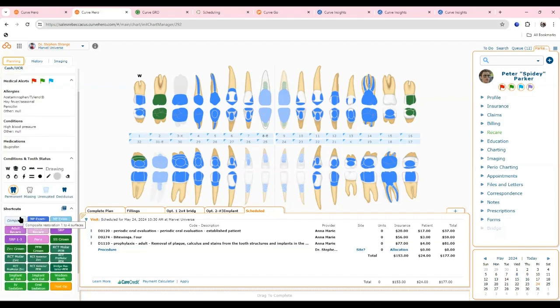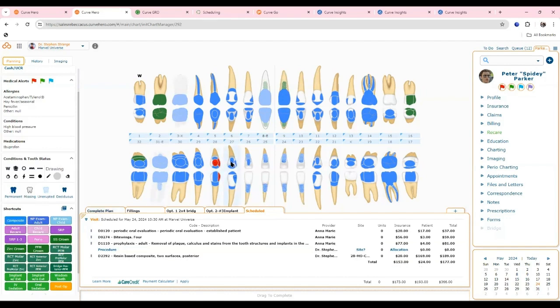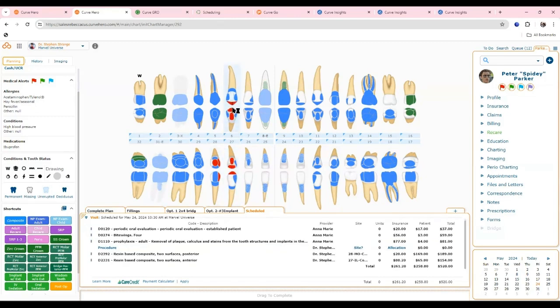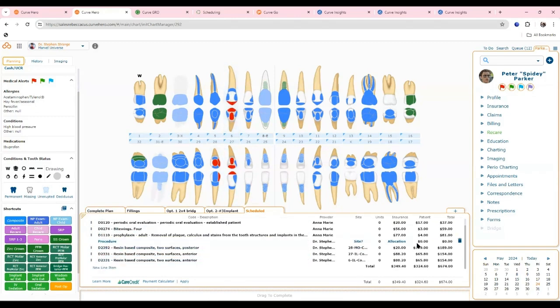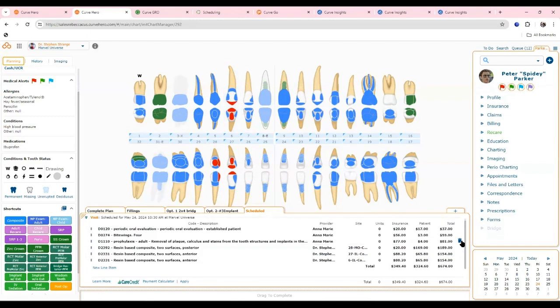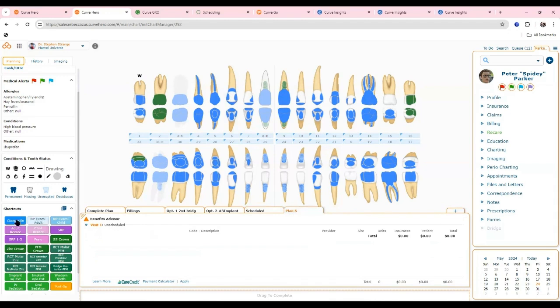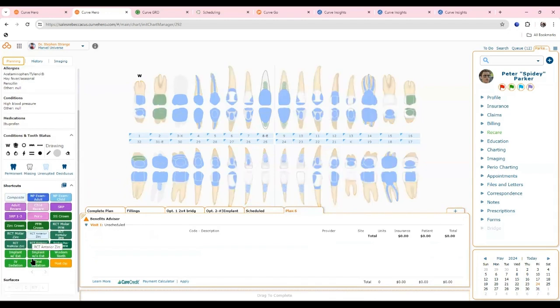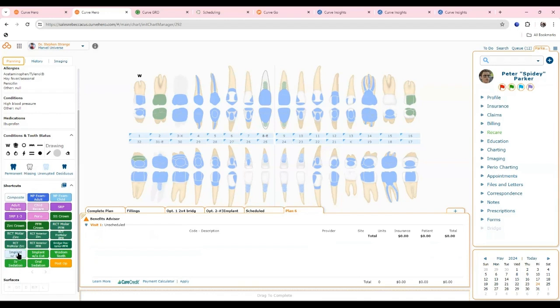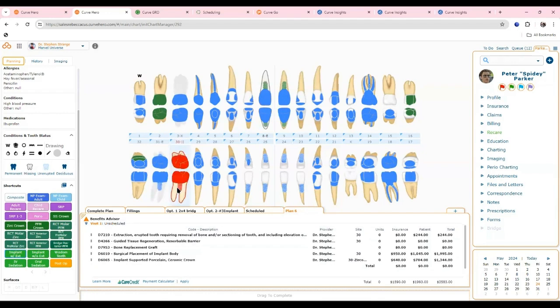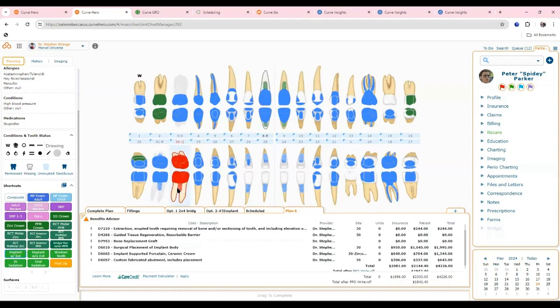There's a composite button for quick treatment planning — just drag and drop on surfaces of the teeth and the codes appear at the bottom. Shortcut buttons group codes together for procedures where you always use the same codes. When you click the implant shortcut button and then the tooth, all those codes group at the bottom automatically.